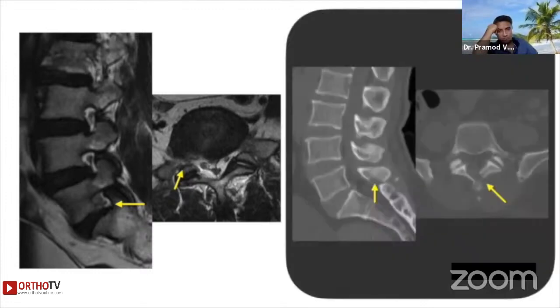And if you look at this CT scan, you can see a small hole in the opposite interlaminar space at the base of the spinous process and just at the superior lamina. Very minimal invasion of the spine.